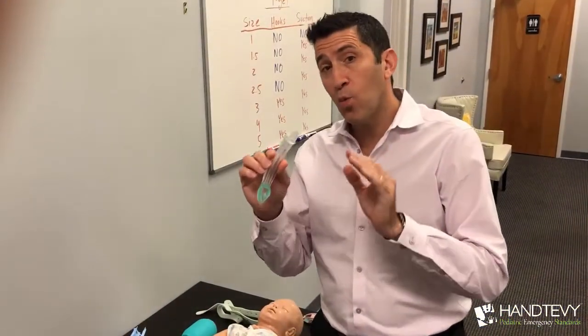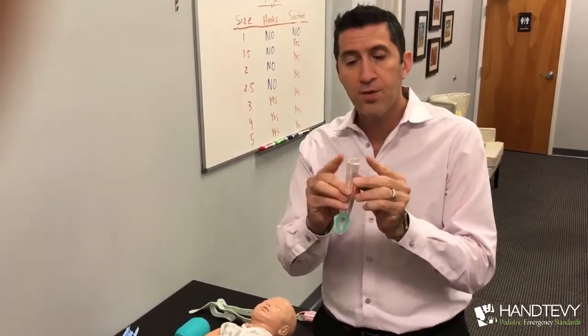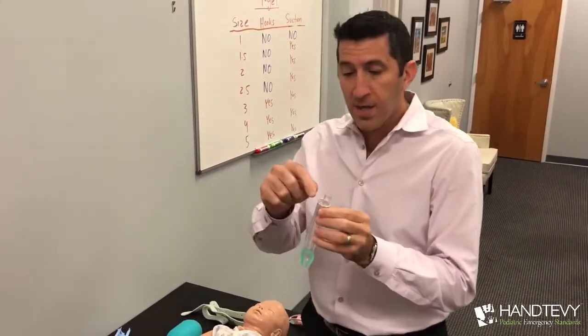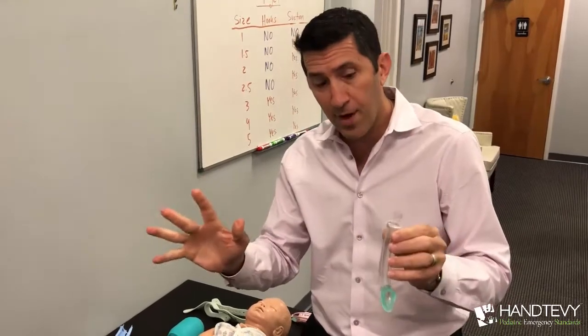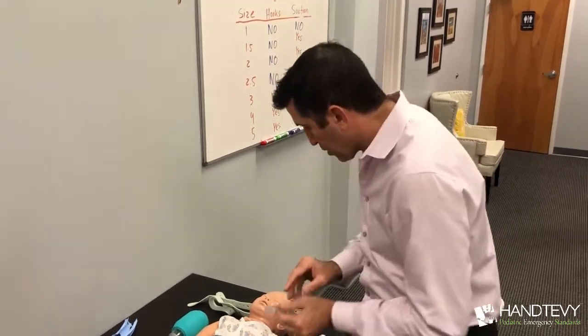Now I've gone down to the 1.5. Remember, anything below size 3 — the 2.5, the 2, the 1.5 — those hooks are not there anymore. That poses a problem with how to secure the i-gel once you've inserted it. What it does still have is that port for suction for the Salem sump — still fits the same 12 French. We'll show you a new way we're actually using to secure it.